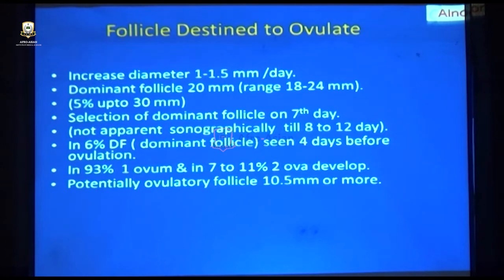Don't send the patient home by simply advising that you have to take tablets for 3-5 days this month, the next month, and then the next month. Please, let's stop this business because there are a lot of consequences, and I'll show you what the complications are. Always support them with ultrasound monitoring, and if the follicle is reaching the size, then you can manage it and she can be pregnant. Number two, you can calculate the dose. Whether the dose given this month is sufficient or an overdose, all of that is calculated by your ultrasound department.